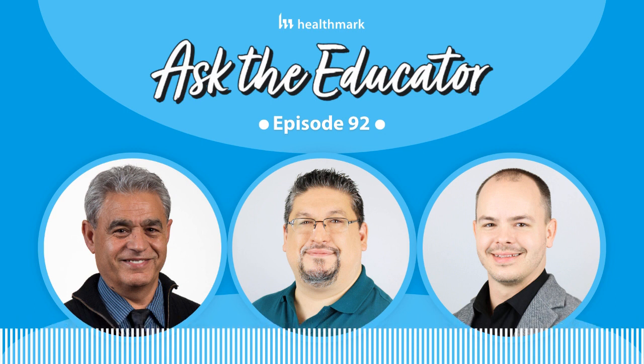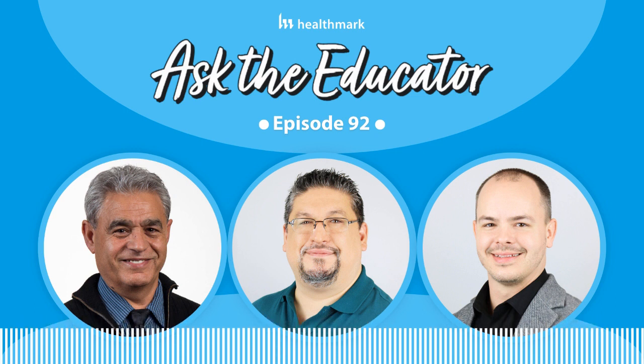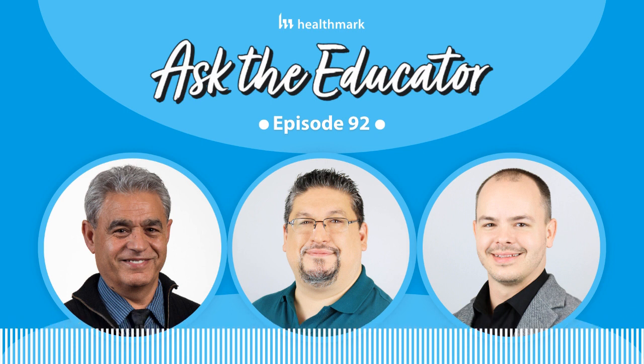So for biomed techs, obviously, every biomed or HTM technician has an ohm meter and voltmeter in their possession. Those are what you use to make sure that you have adequate cords and adequate procedure, and then the reading is 0 or 0.4 or what have you. So we found that if biomed was responsible for these cords, they would test them using the ohm meter, and that's the manufacturer recommendation. But we found out at Healthmark that obviously people are not testing them.